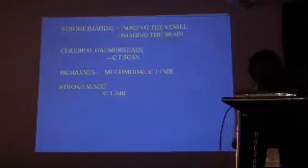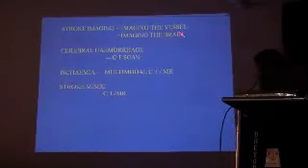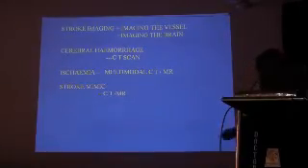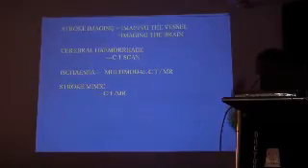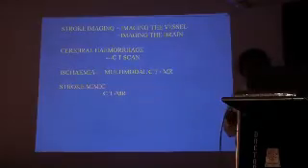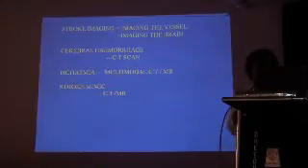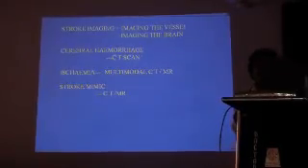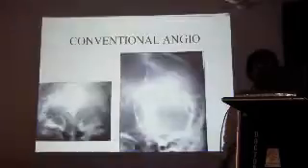If you think of ischemic stroke, go for multimodal CT, CT perfusion, CT angio or MSCT. If you suspect stroke clinically, or non-stroke, do CT or MRI. Say meningioma, as I have told you, there are so many stroke-like patients I have shown you. These are not vascular episodes, but may be due to meningioma or tuberculoma or granuloma, etc. That means all these cases should be examined with MRI or CT.